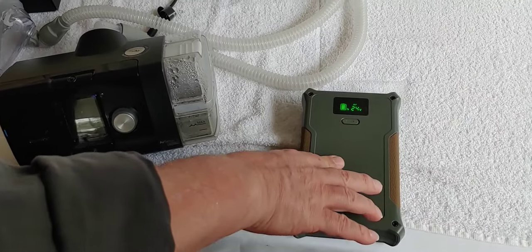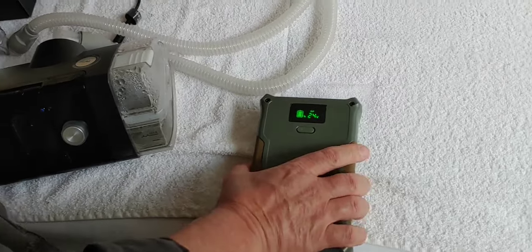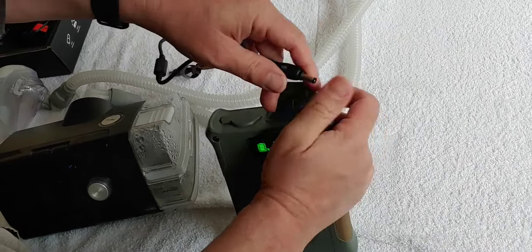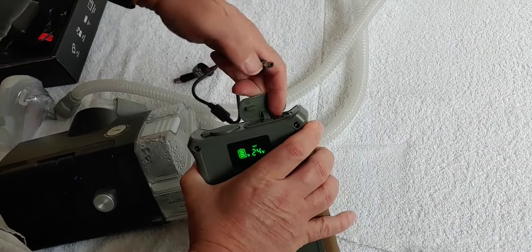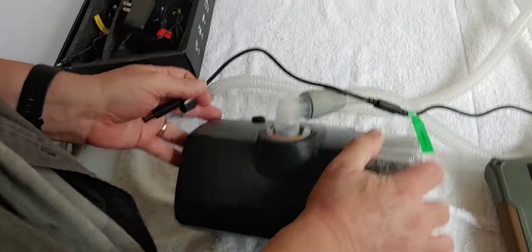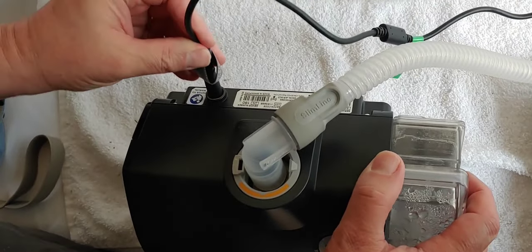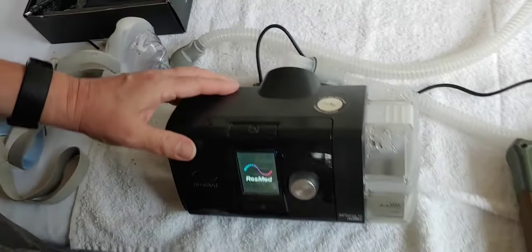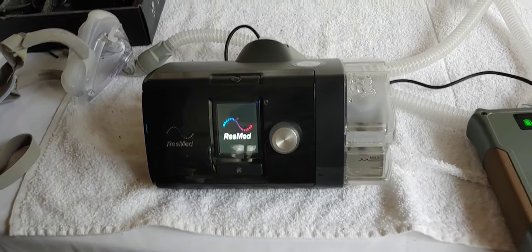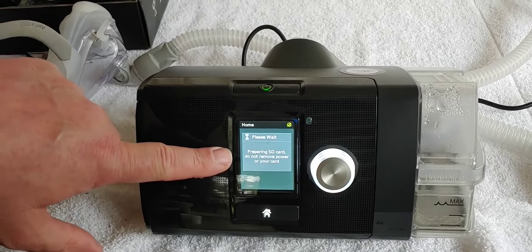I've set this up for 24 volts. Now we're simply going to take the cord that came with it, connect it into the power system, and then into the CPAP machine where you would normally plug up your device. As you can see, it came on — lights up — and it will at this point do its normal charge and run up. And that's as easy as it gets.